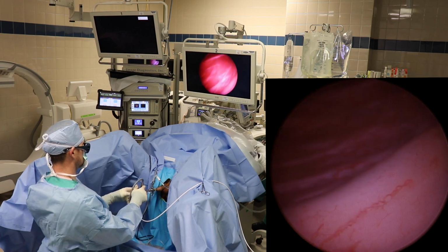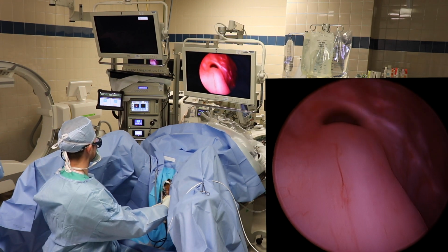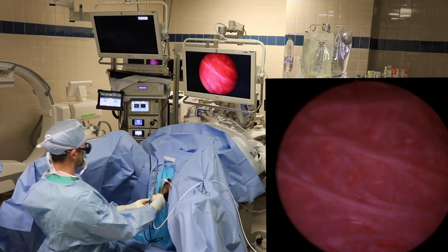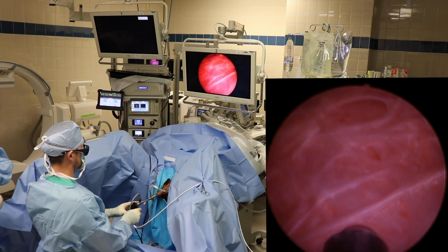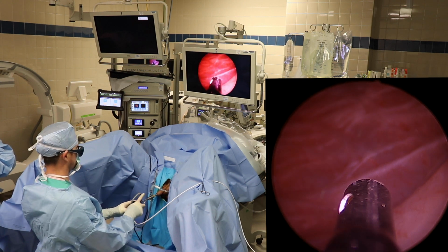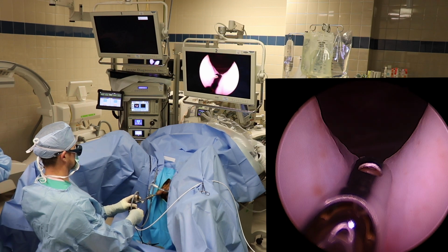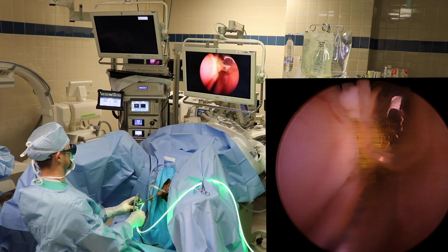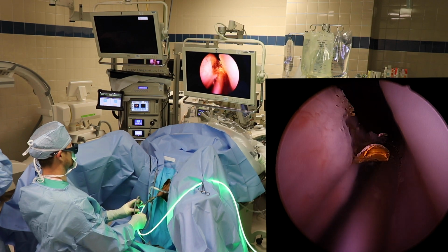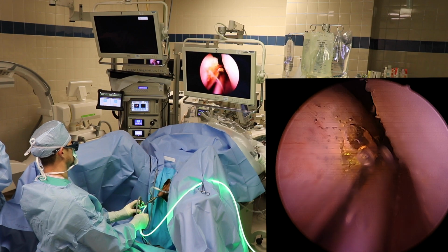As you can see, we are looking through the bladder, ensuring that we can find the ureteral orifices. You see a small median lobe mound that's in the middle of the prostate lobe, and you also see the diverticulum and trabeculations in the back of the bladder on the right side of the patient's bladder. Then you can see the laser being deployed, and initial firing of the laser fiber vaporizes the tissue with bubbles as exhaust of the vaporized tissue.